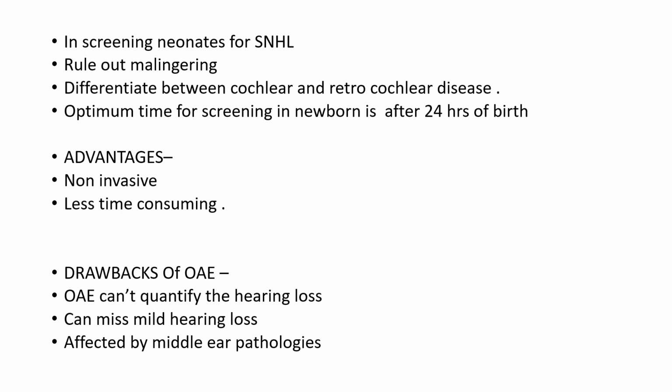As it is a qualitative test, it can't quantify the hearing loss like audiometry or other investigations, that is, what is the exact degree of hearing loss. Okay, and it also can miss very mild hearing loss. It also gets affected by the middle ear pathology such as middle ear effusion or retraction, etc. So these are the few drawbacks of otoacoustic emission.